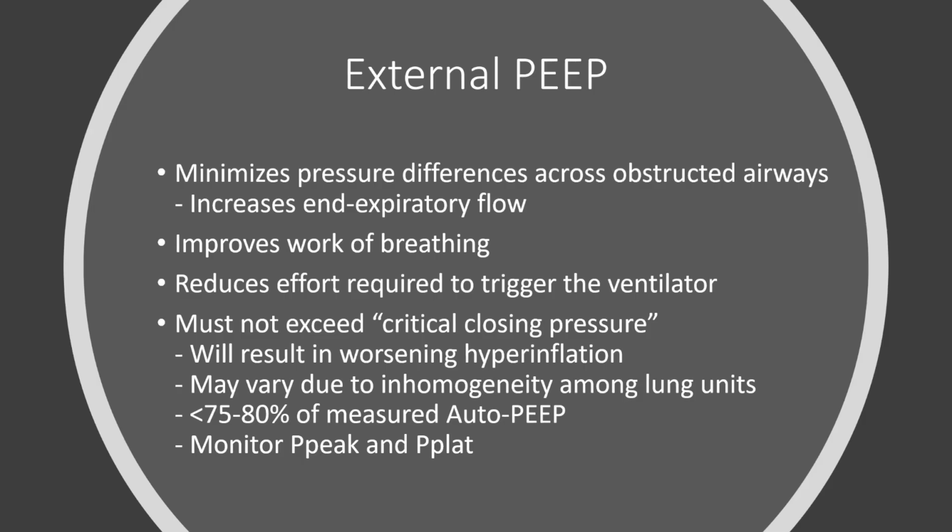Typically, let's say the auto-PEEP was 5. You don't necessarily want to match it by 5 because certain lung units are inhomogeneous, and maybe their waterfall is a height of 3, and another waterfall might be a height of 4, while most of the waterfalls, meaning different lung units, have auto-PEEPs of about 5. So if you apply a modest rise, then you are likely on the safer side.